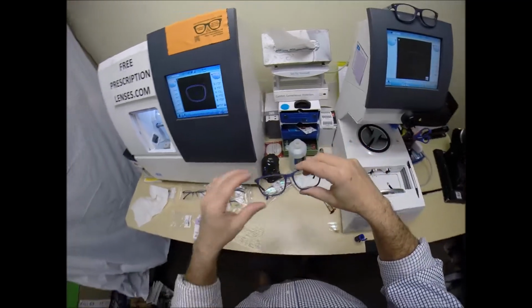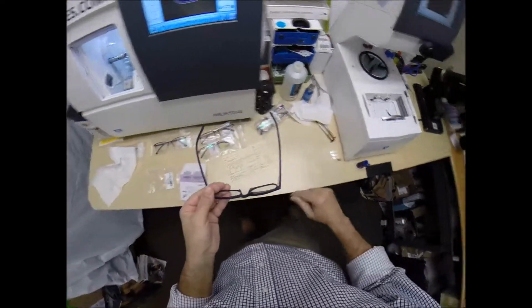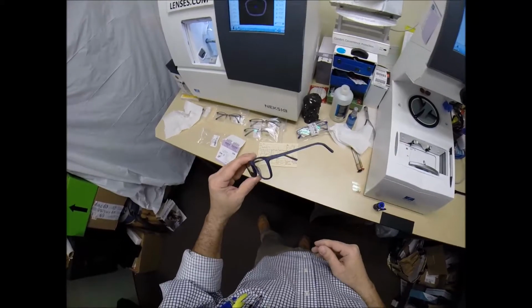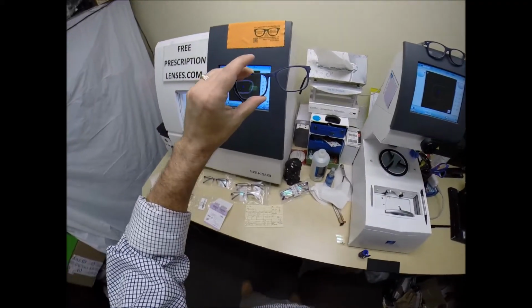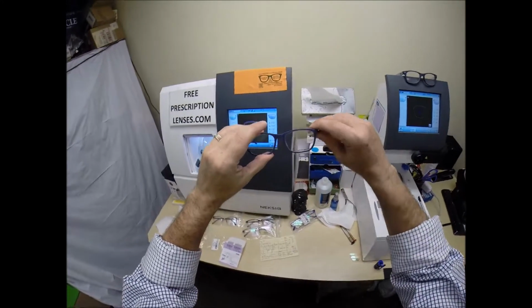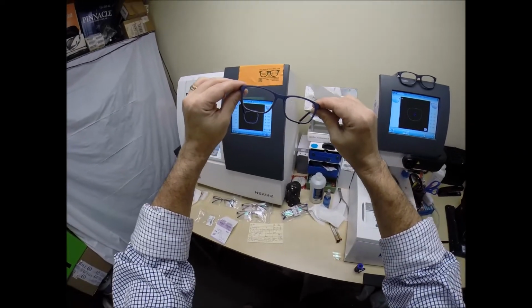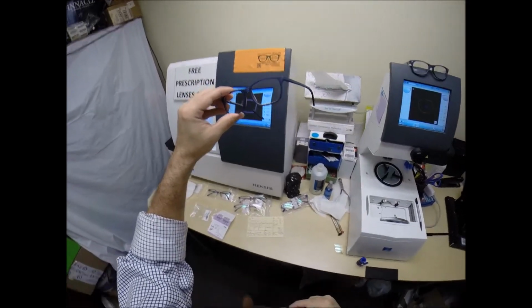But, so, I'm going to get these, hang on, let me back up. 99% of all optical shops will do free adjustments if you ask them. That's because 80% of people have one ear that is higher than the other. But when you do get these in the mail, there's a small chance that these could fit too loose or too tight. However, there's an 80% chance that one side is going to sit higher than the other. And because of that statistic, 99% of all optical shops will do free adjustments.